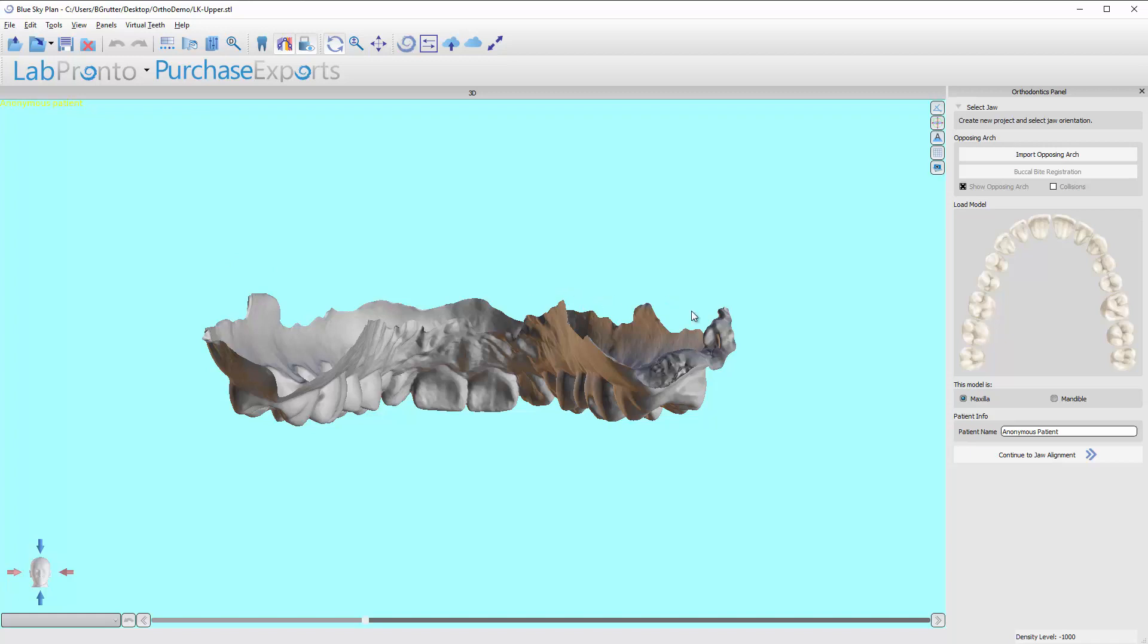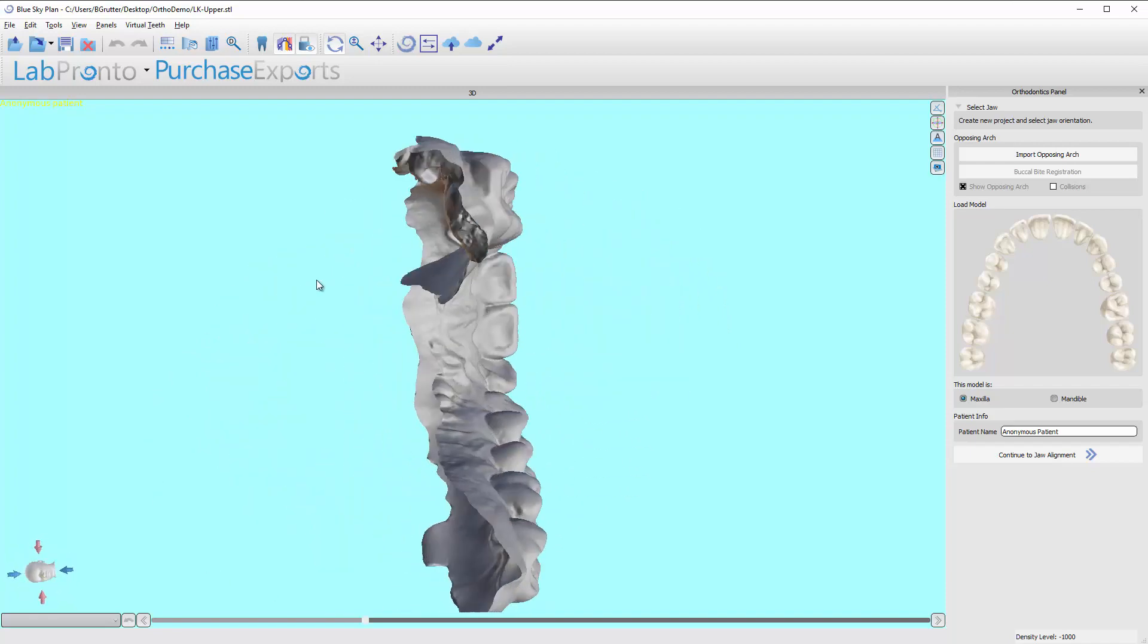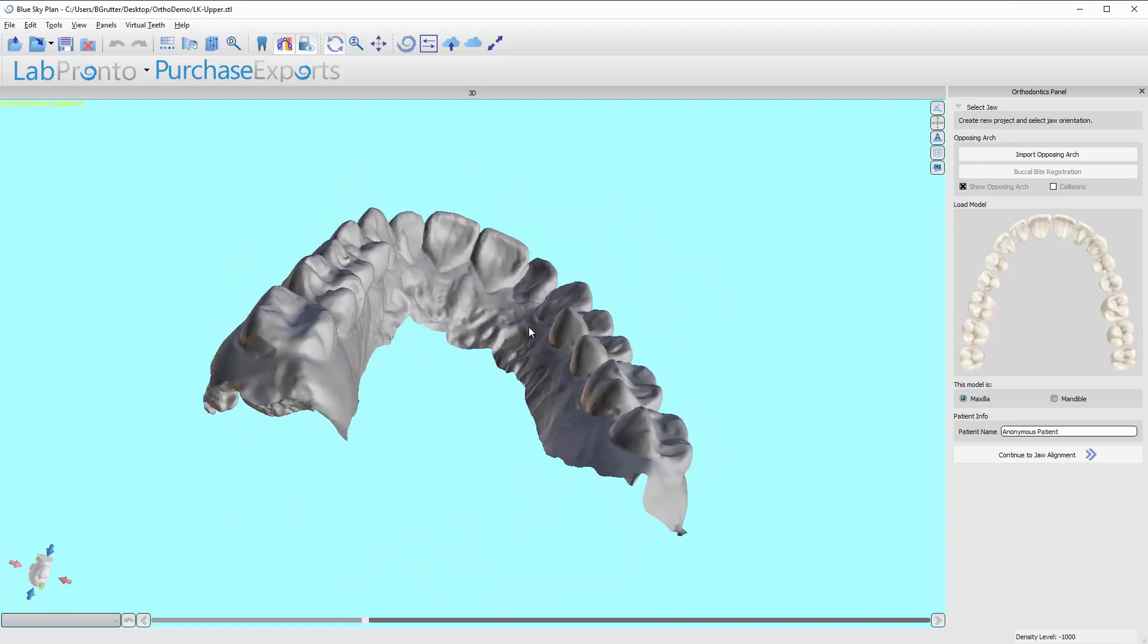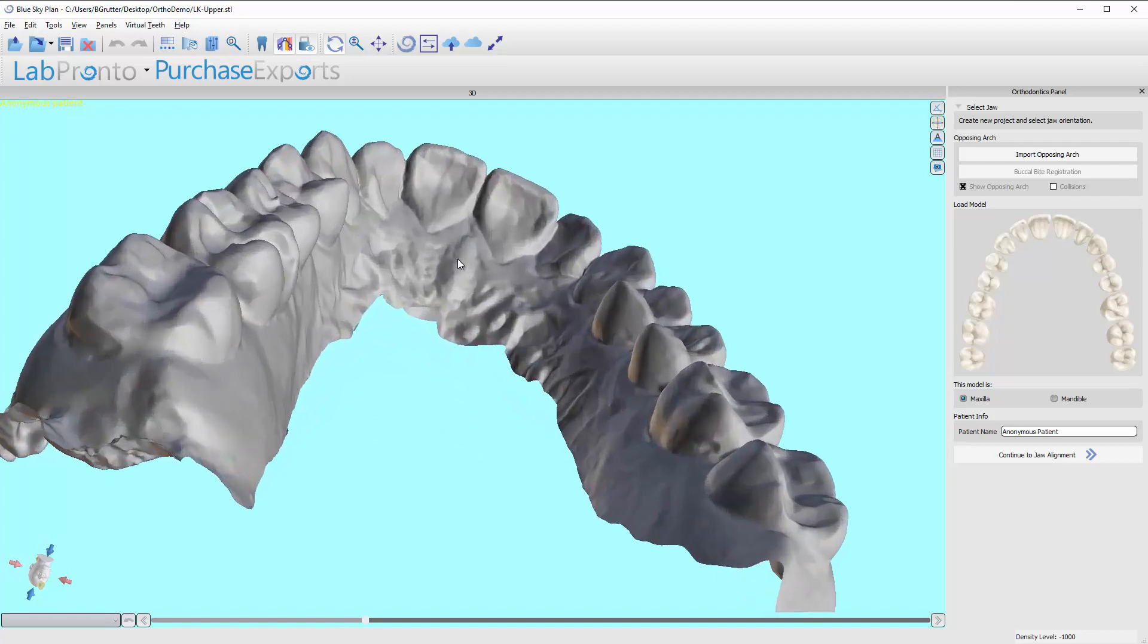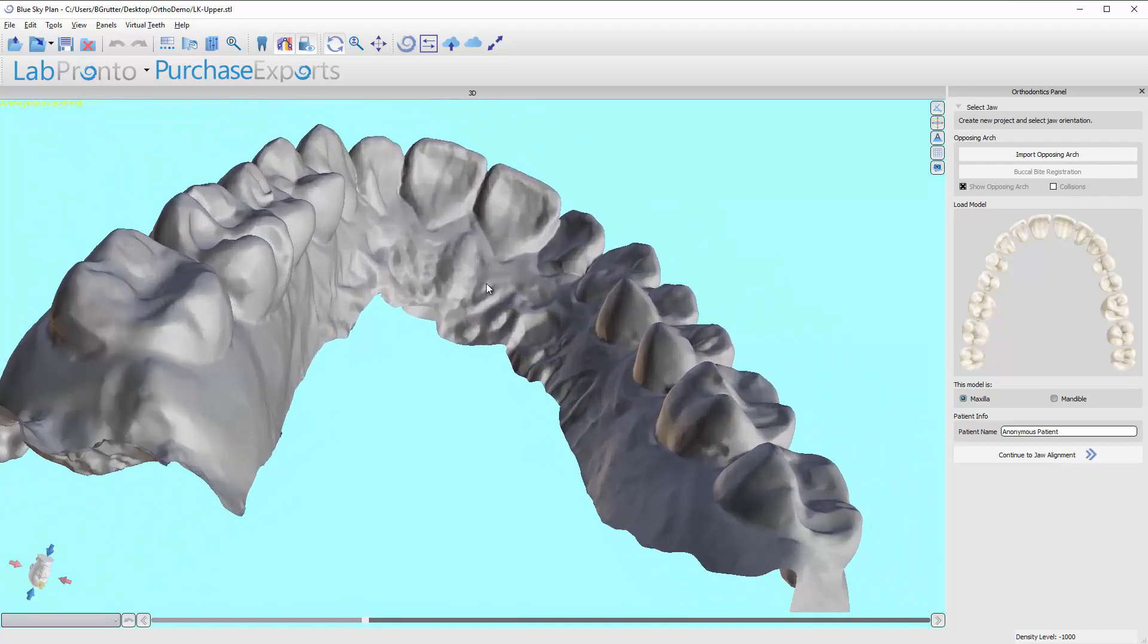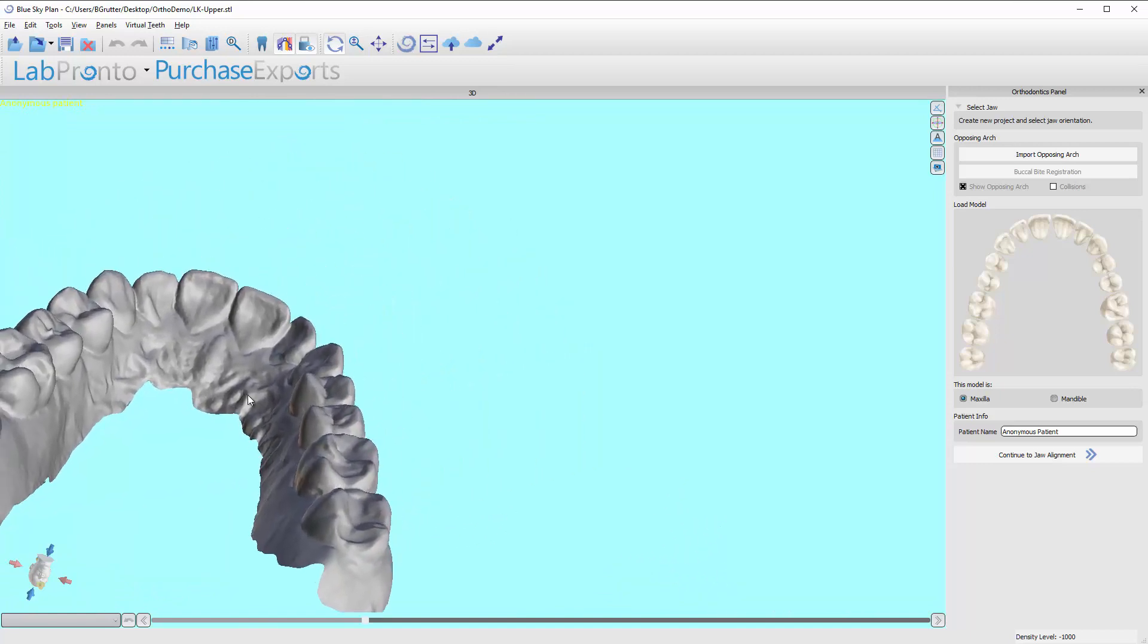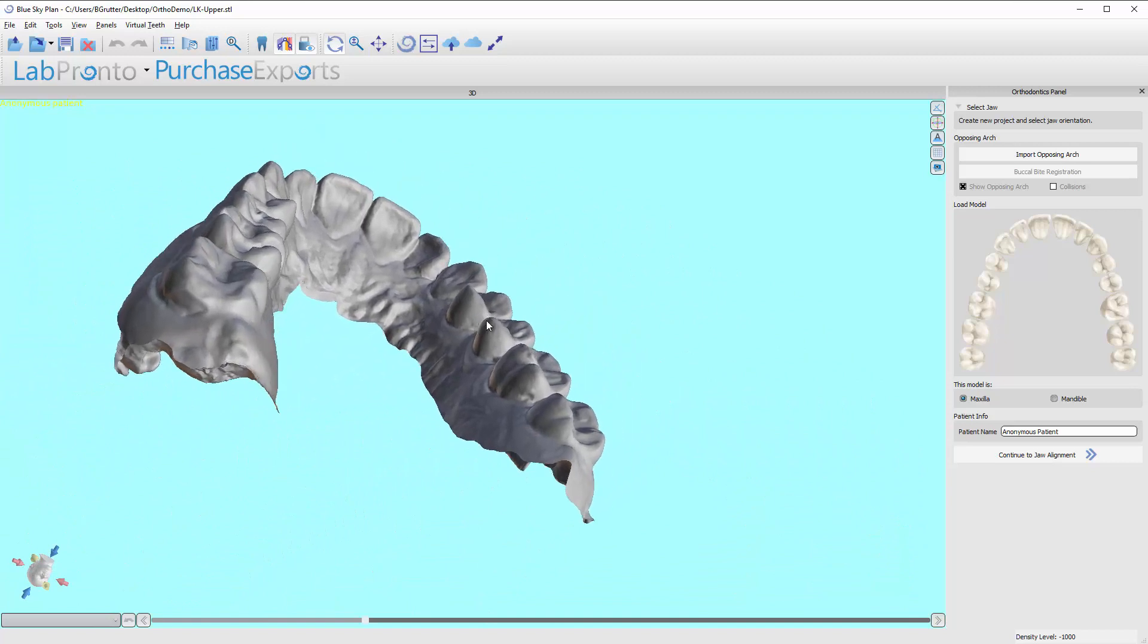Some navigation tips. If you press your left mouse button, it allows you to toggle the model around. You can swing it all around. If you press the right one, it allows you to zoom in and out. If you press both of them, it allows you to translate or slide it around.